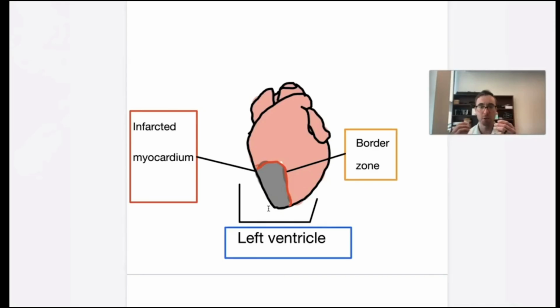If you look, those impulses or the reentry pattern are actually coming from that area, and standard defibrillation doesn't depolarize enough of those cells to convert ventricular fibrillation into a normal perfusing rhythm. Once again, standard defibrillation does not apply enough energy to depolarize those cells. So if you switch the vector around, you're more likely to depolarize that inferior portion of the left ventricle to hopefully convert them.